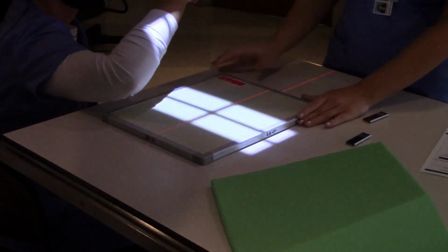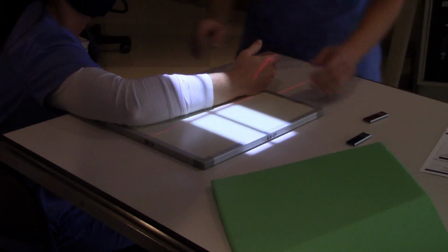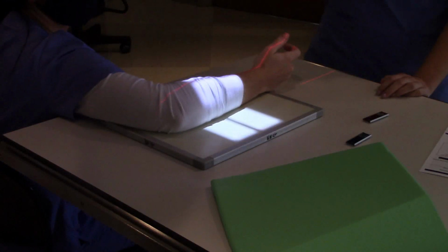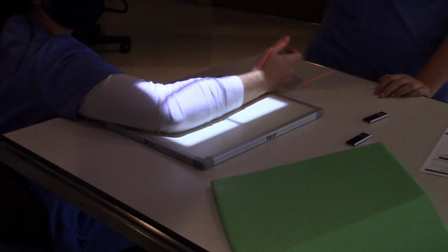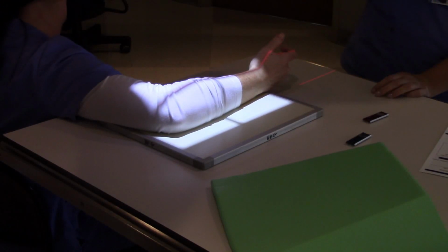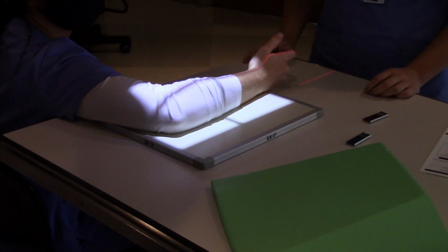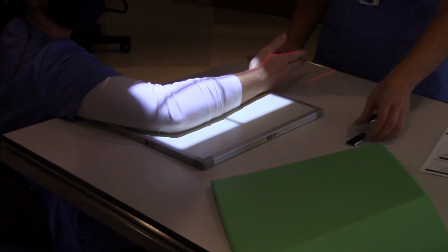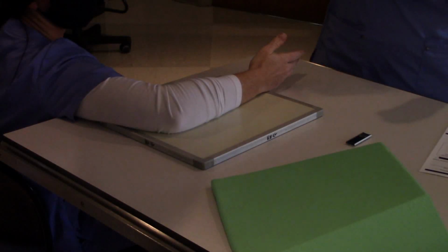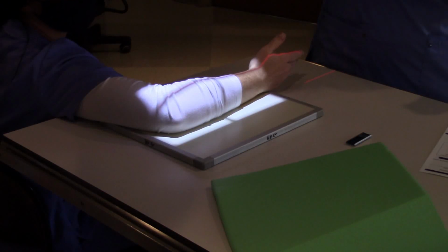And next. All right, now for our next trick. There you go. Move that patient. Don't let them slack off. All right, now we just need marker, shield, and shoot. Right arm. Actually, I could do a little more. Should I collimate it a little more, like the side to side? Yeah, you can come down the skin line side to side.